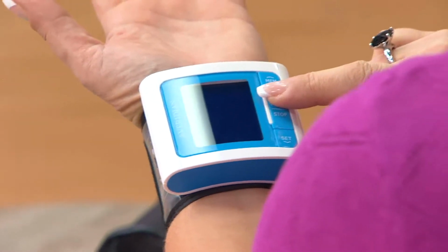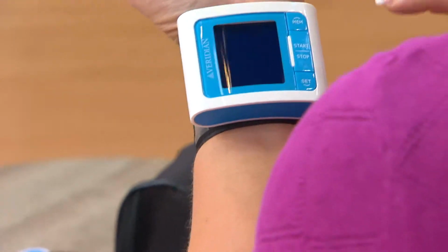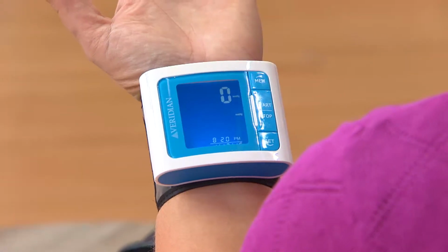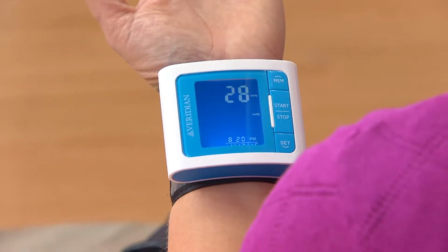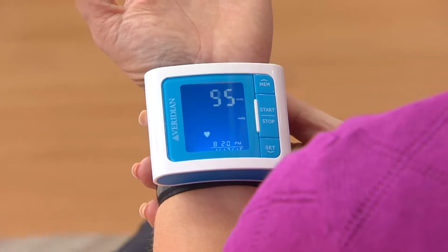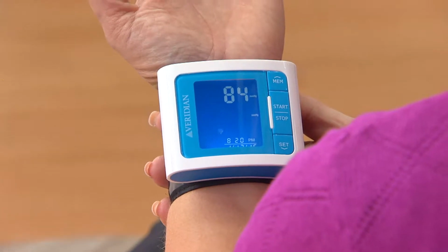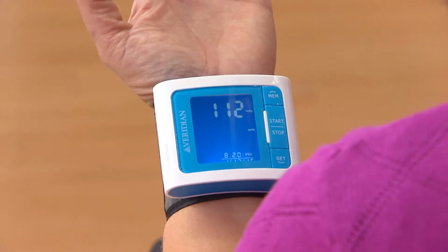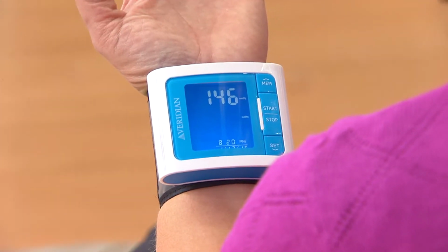Once I do that, I'm going to stop talking because you're supposed to keep your legs uncrossed and stop talking. I'm going to press the start button. Here we go. Okay, so I'm going to talk, and you hear it now, and it's reading Lori's blood pressure. You've got your top number, which is what? Systolic. The bottom will be diastolic. That's the blood pressure going away from your heart and coming back into your heart. And it will also give you a pulse reading. And you see that little heartbeat down there.